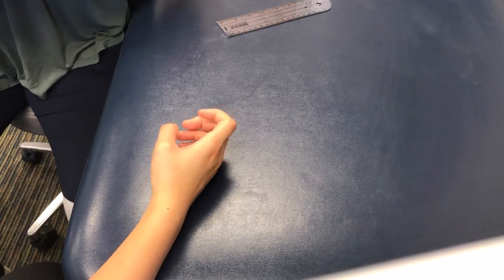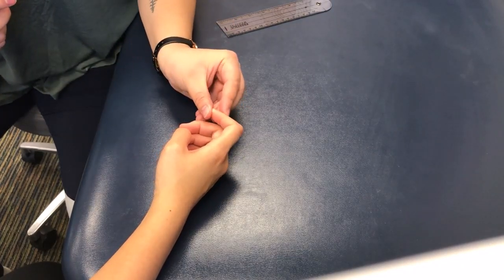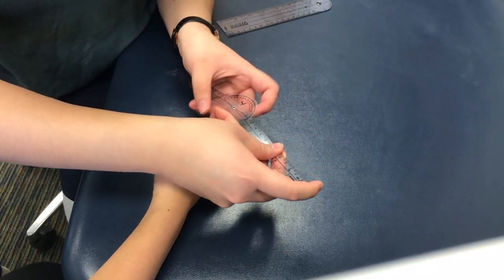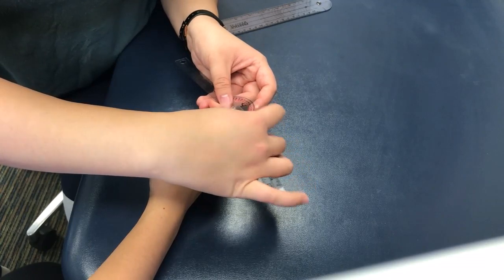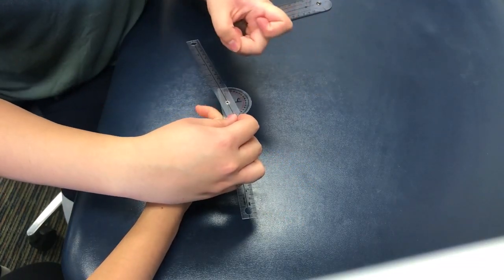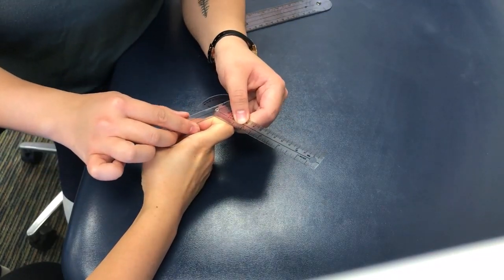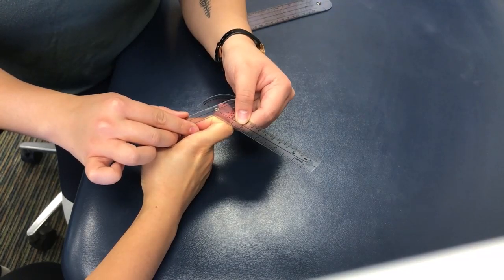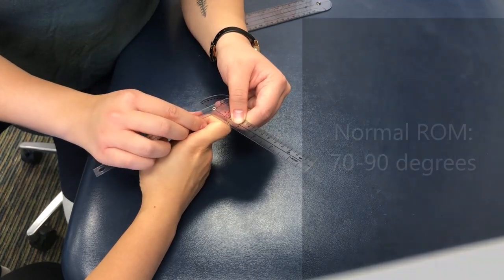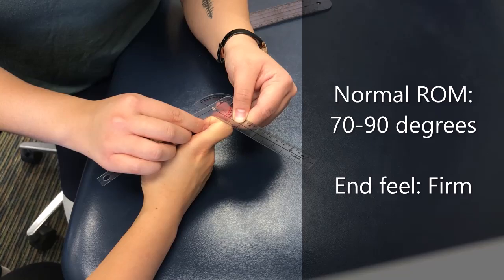For DIP finger flexion, you're going to put your axis on the dorsal side of the DIP joint, and the proximal arm will be on the dorsal side of the middle phalanx. And then the distal arm is going to follow the dorsal side of the distal phalanx. So go ahead and curl your finger for me. And for active range of motion, it is at 68, and then for passive, push into end range, and it is at 84.